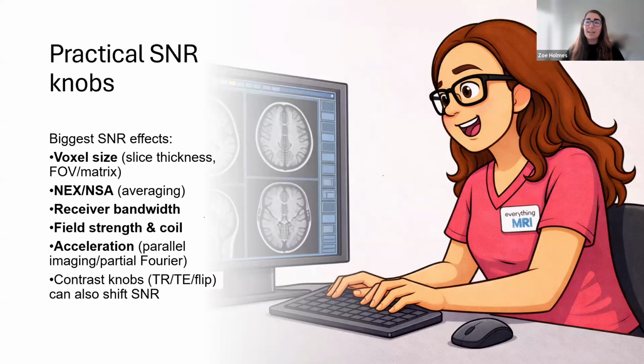So some practical recommendations. When someone asks you to optimize something, don't start cooking and go for 5 knobs at any one time. It's exciting to click all the buttons, but it's going to be so hard for us to understand, if we're doing multiple ones, to then backpedal and go, okay, which one did work and which one didn't work.